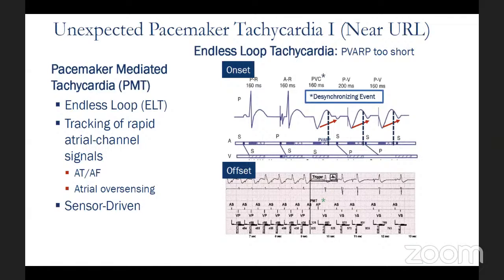So when I ordered an MRI, I got an angry call from the radiologist saying she has an abandoned lead and we can't do the MRI. And then I wasn't in the mood to argue last night, so I just said, okay, I'll ask my colleagues in the morning. So why is an abandoned lead a contraindication to a cardiac MRI? And those are my two simple questions. Thanks.